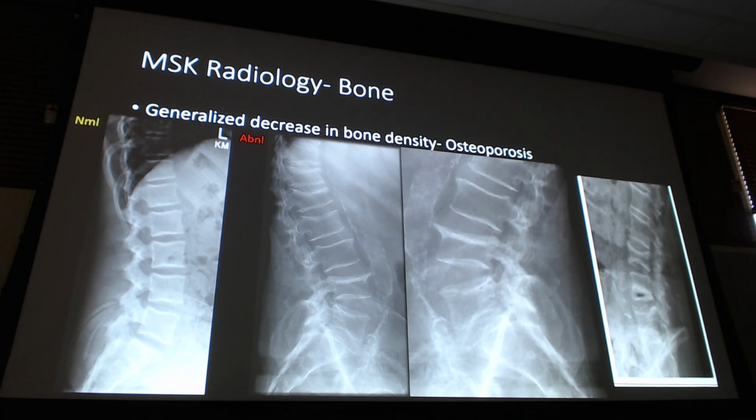Okay, yes, sir? So just to define, if you're using the term sclerotic, like in the ABA presentation, do you use that to describe this as well, or more so radiolucency? So different, right? I'm using radiolucency, because remember, sclerotic is a reason for more radiopaqueness. Radiopaque and radiolucency we are using to describe either the darker or the lighter, okay? So you can say sclerosis causes a radiopaque section of the bone. But sclerotic is a process within the body. Radiopaque is just describing the density on the film. Does that make sense? Yes.